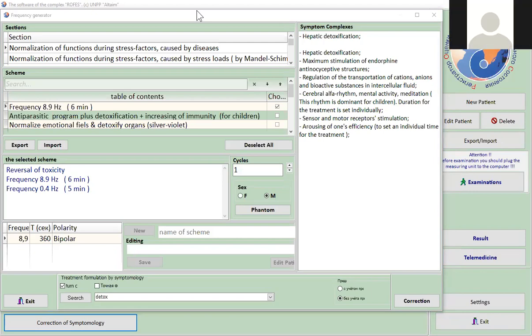If someone has it on their hand and they're using their phone throughout the day, does that cause a problem? It can deprogram them a little bit, but it is a pretty long distance, and it's already in connection with the body. So I don't think it will reprogram them, it's not such heavy magnetic radiation. Seems like it would be a good idea to just tell the client to wear it during their sleep. Even better, yeah. During sleep, it will be a little bit more time, but I don't think that it will do any harm.